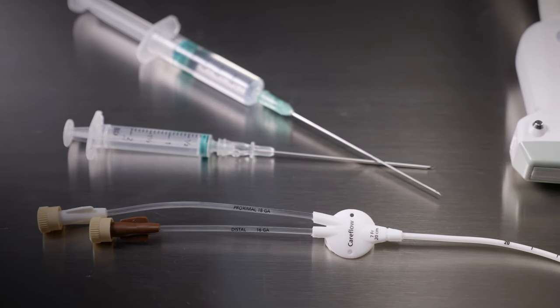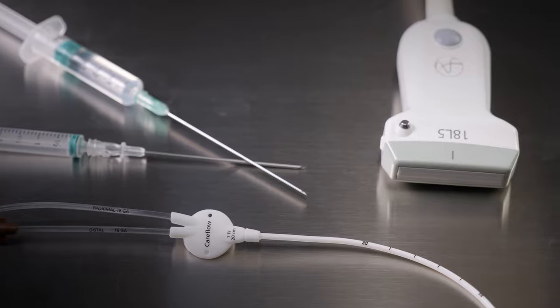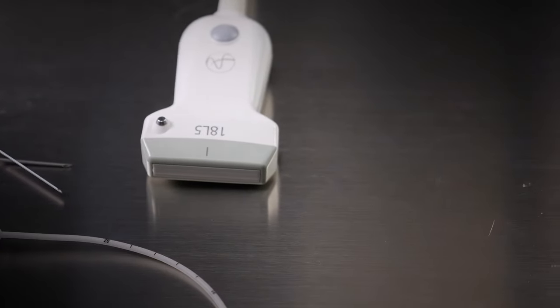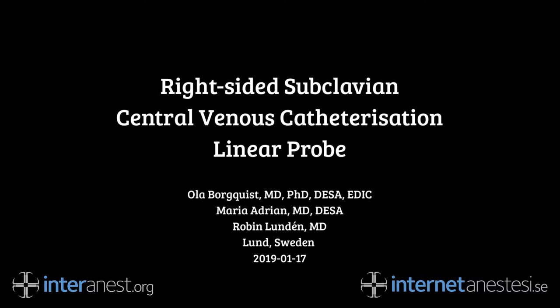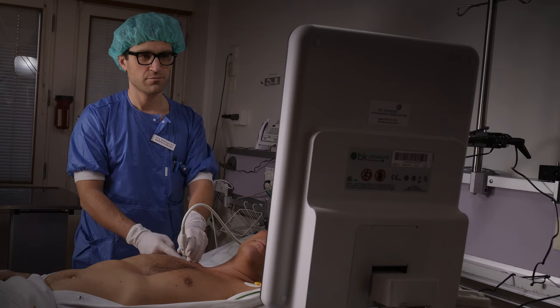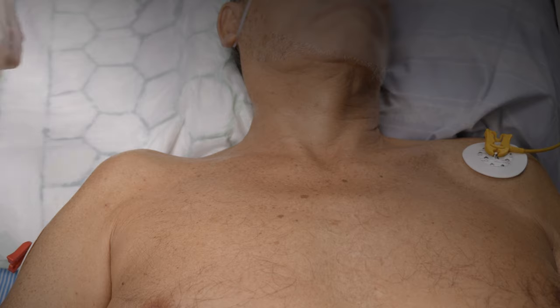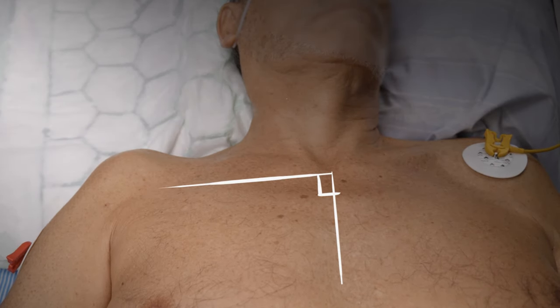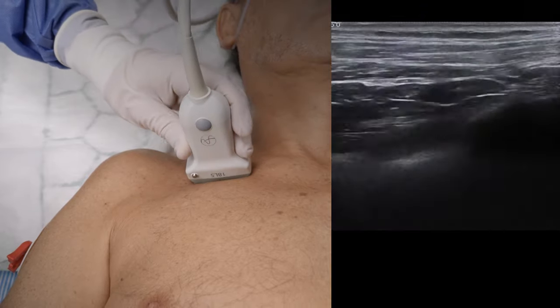This is a demonstration of our preferred method of right-sided subclavian vein catheterization using a linear probe. Be sure to have a comfortable working position with the ultrasound machine within your line of sight. Start by identifying the clavicle, then visualize a line at a right angle to the body's midline and align the probe with it.